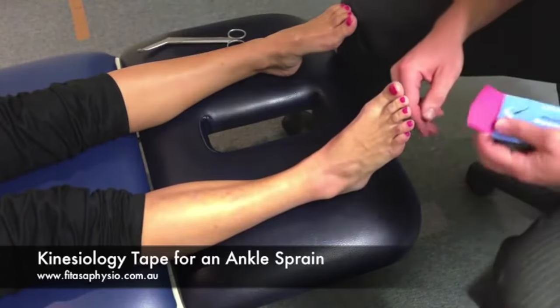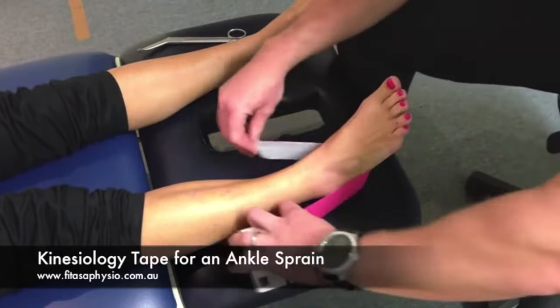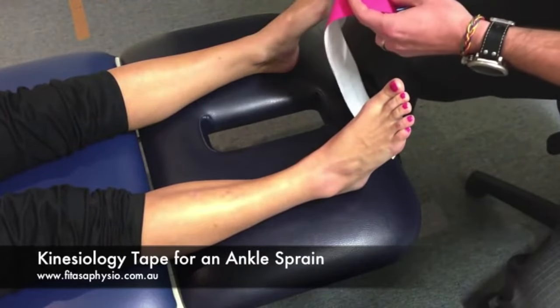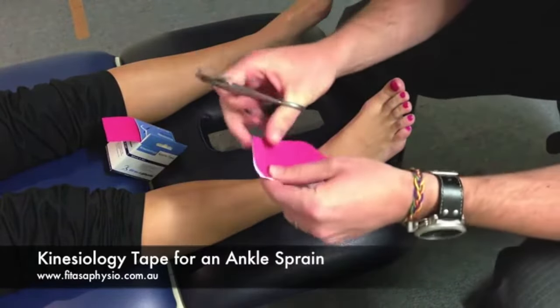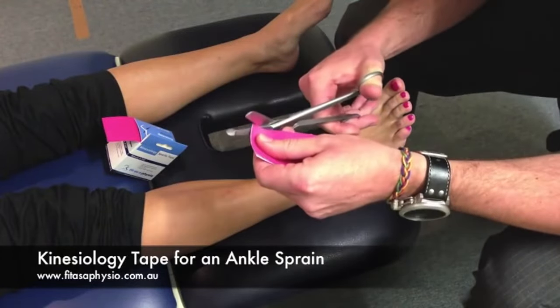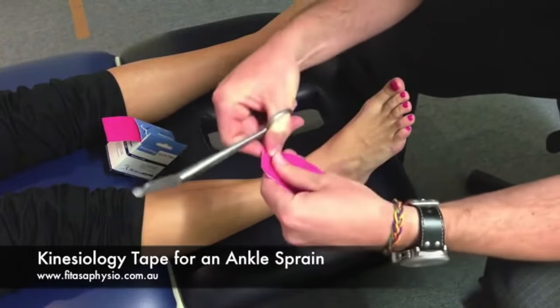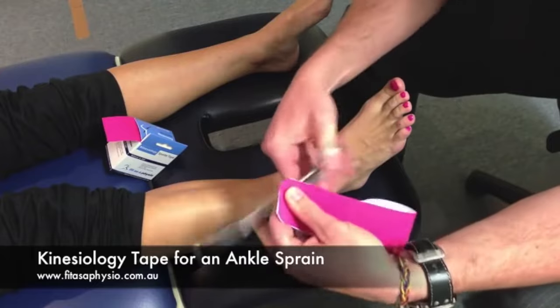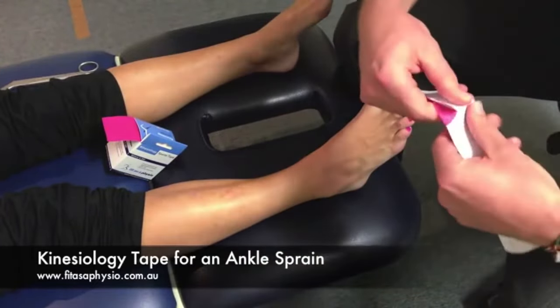I'm going to use a pink tape to match her beautiful toenails. I'm going to measure up a length up each side. Rounding the corners — it just stops the corners catching on things, so your tape quite often lifts up from the corners first. Tearing it in the middle.